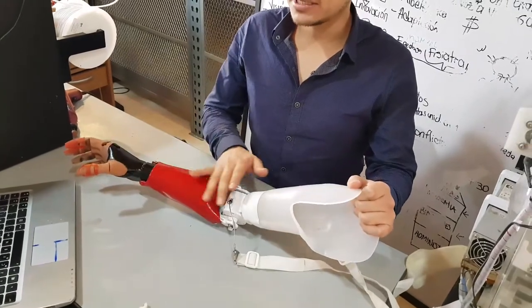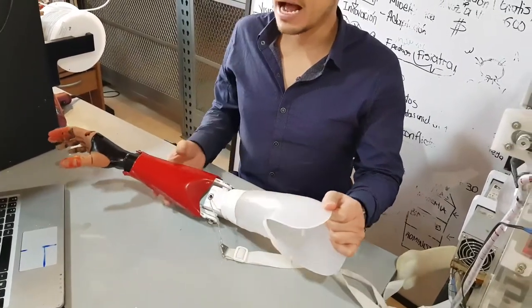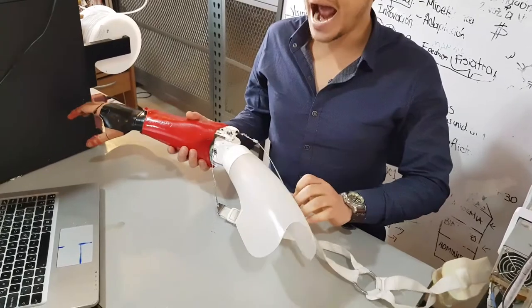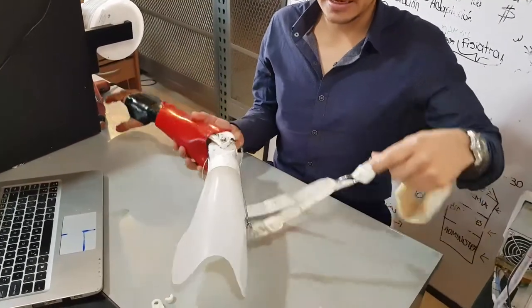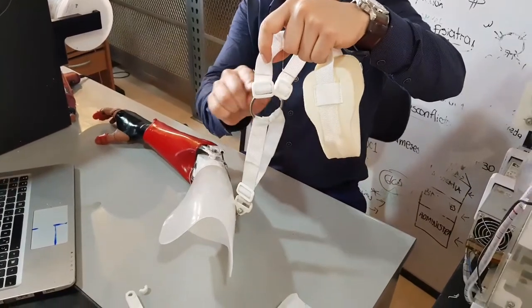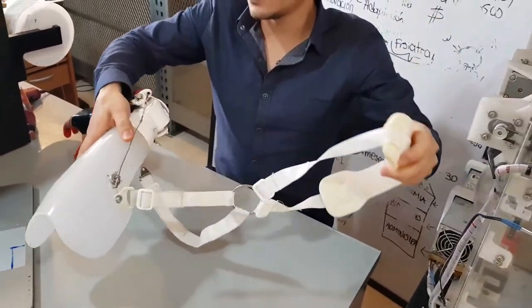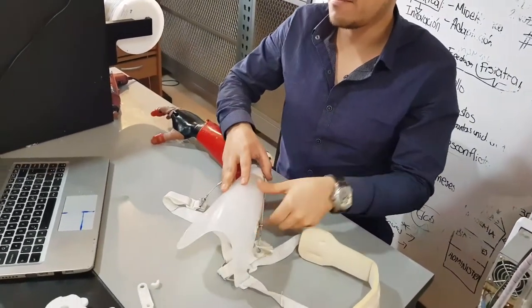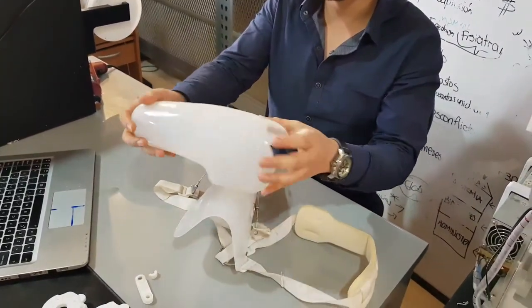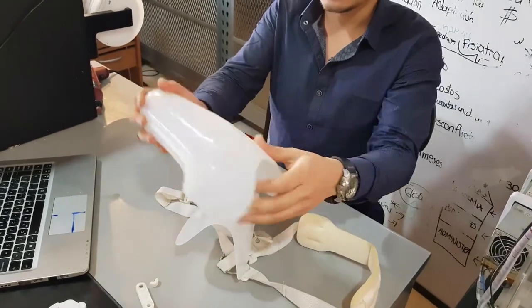The 3D printed prosthesis is activated by a scapular action with a harness. This is the harness with a ring, and it is composed of a polycarbonate socket made in an orthopedic lab.